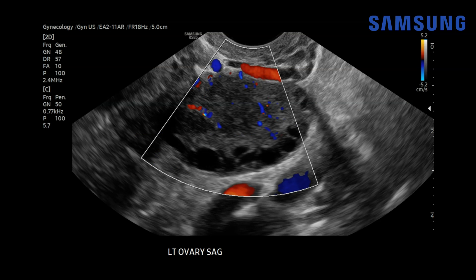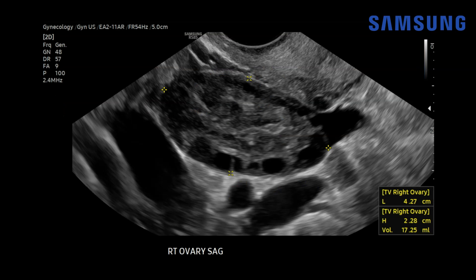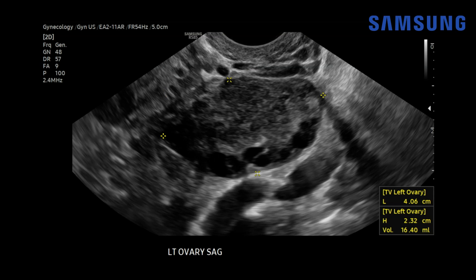Same thing on the left — no focal mass or focal dominant cystic lesion, just normal vascular flow. Now let's measure the ovary. The right ovary here demonstrates a volume of 17 milliliters or 17 cc's, which is enlarged, and the left ovary is similar at about 16 cc's.